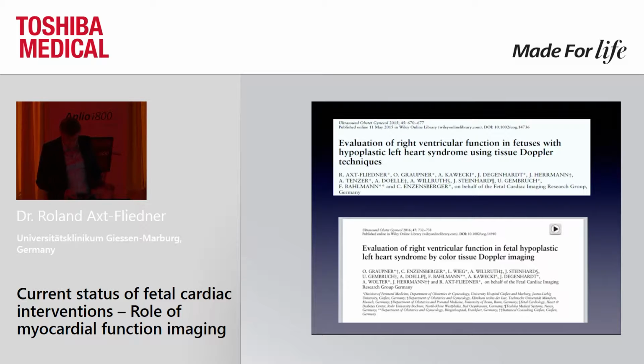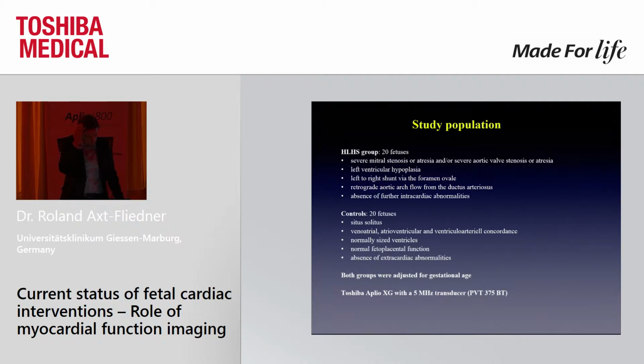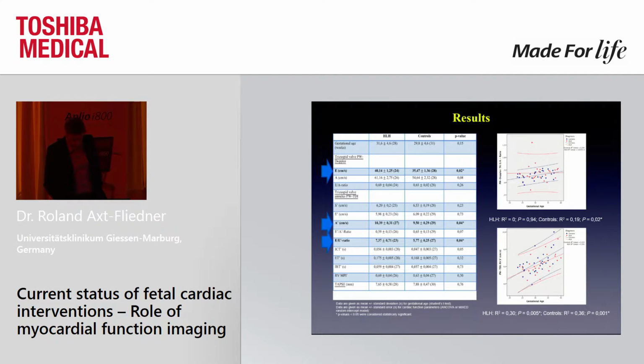So these were the two papers which came out by our group on these topics. And we had there 20 fetuses with hypoplastic left heart included. You see the inclusion criteria, and 20 controls, and these were matched pairs. And this was done by Toshiba machines.